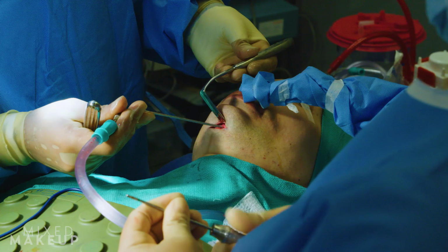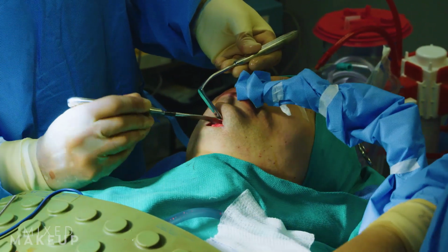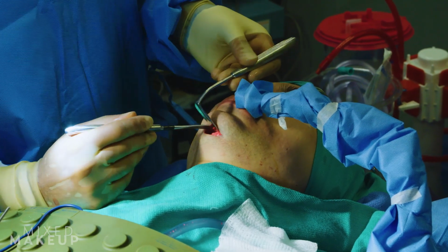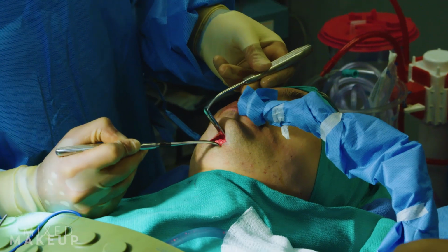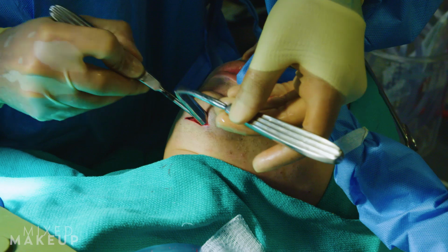So now we're done. We have our chin implant removed. We have the incision well dissected. You can see that there's a little bony prominence here. That's actually a good thing. That's from the chin implant. The new custom implant will fit right on. It gives us something to lodge onto and know that we're in the proper position. So that's great. What we do is we take this dissection down to bone.